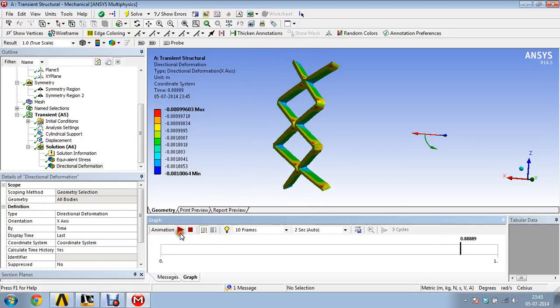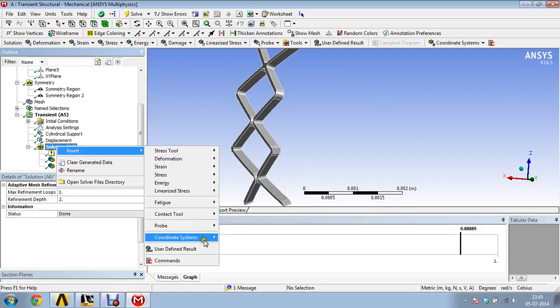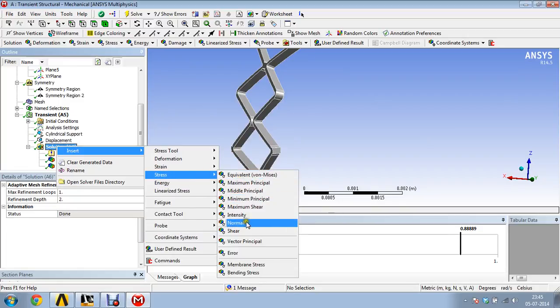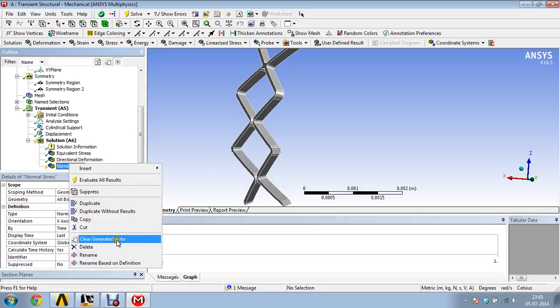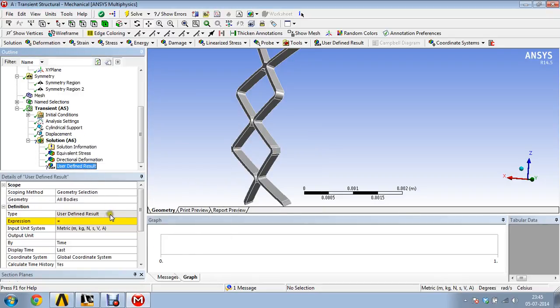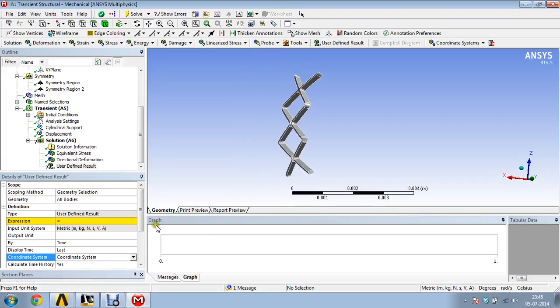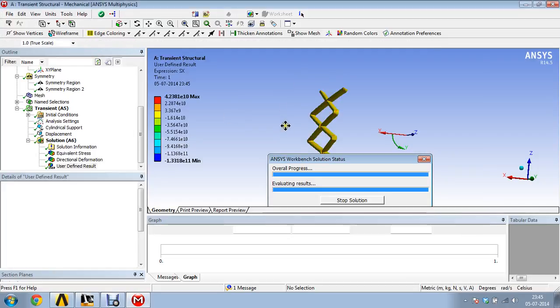Okay, we would also like to find radial stress. So what we'll be doing is insert stress, and it would be normal stress. Or what we'll do is we'll delete this one, and we'll go into user defined results. We'll select the coordinate system, that is a cylindrical coordinate system, and we'll give SX. Okay, so it should give me the radial stress, and let us see what it gives.